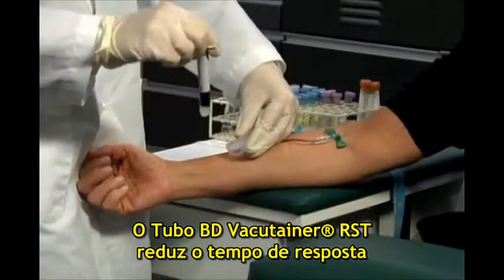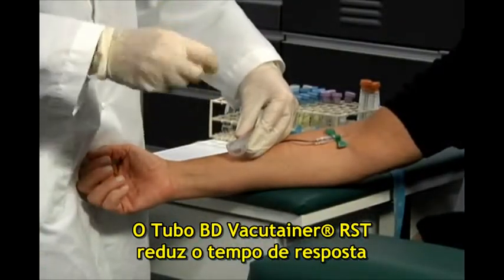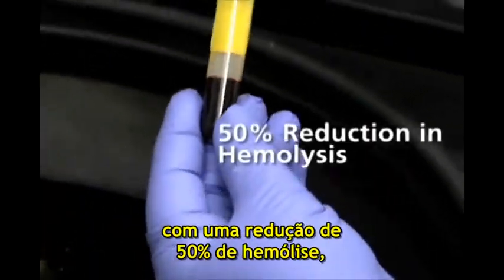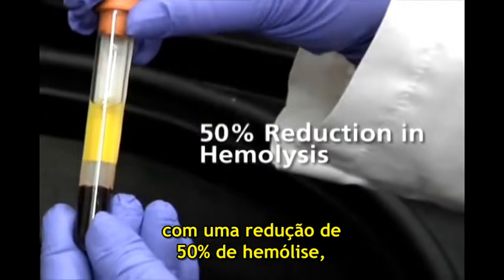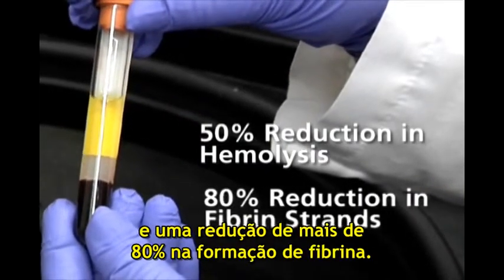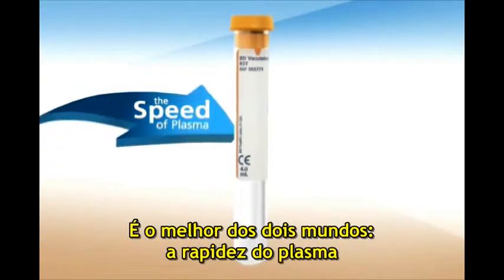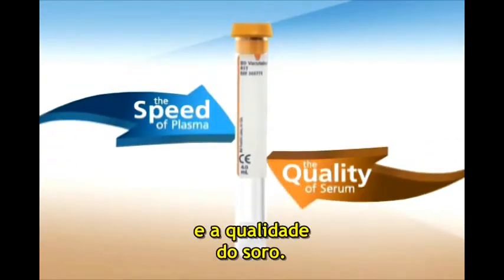The BD VacuTainer Rapid Serum Tube reduces turnaround time and also helps improve sample quality, with a comparative 50 percent reduction in hemolysis and over 80 percent reduction in fibrin strands. It's the best of both worlds — the speed of plasma and the quality of serum.